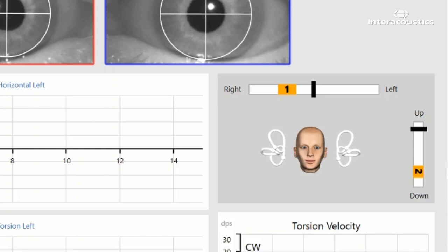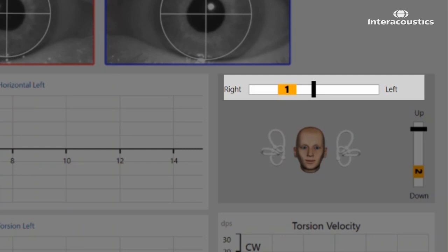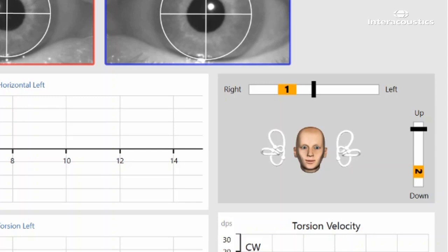A second indicator to the right of the head model allows the examiner to see when the patient's head is lowered to the correct 30-degree hanging position. Notice how the indicators will turn green when the head is within the acceptable angle.